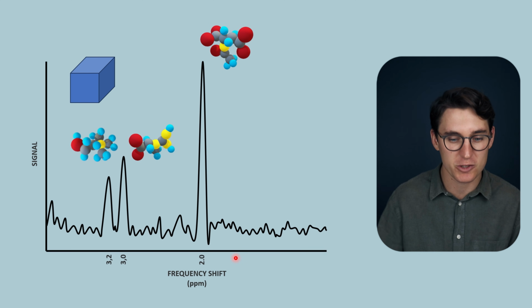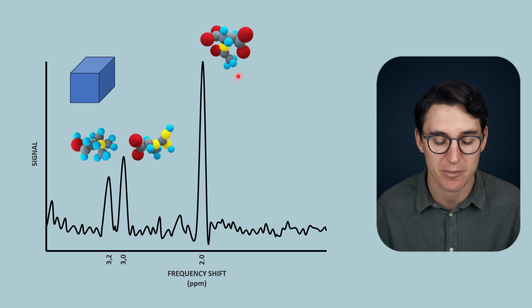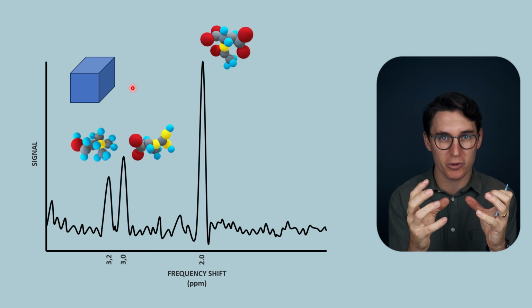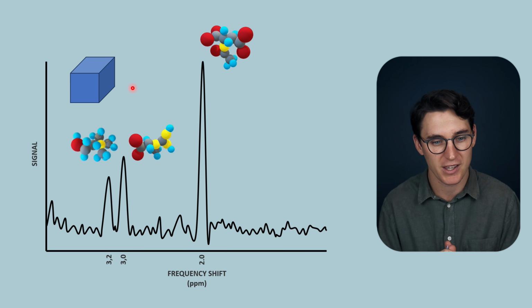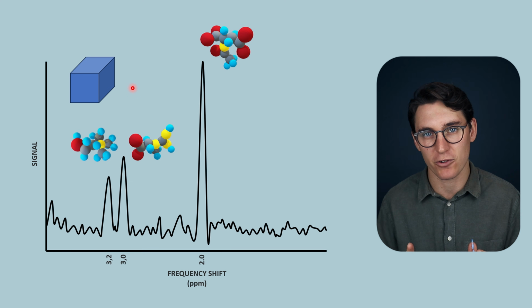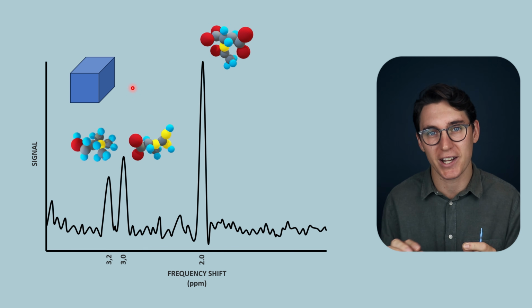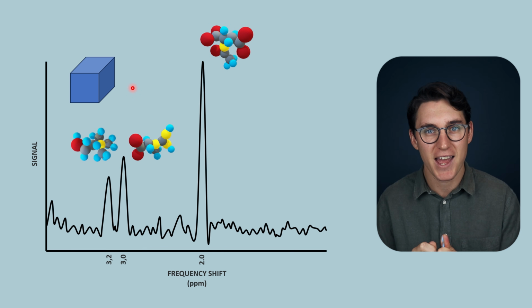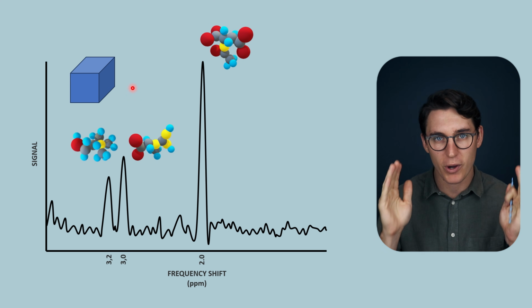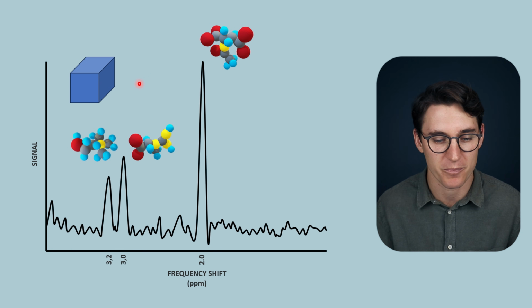And again, when we look at those metabolites, we will see there are specific signal peaks that correspond to certain metabolites. Now, we want to look at metabolites in a specific volume of tissue, or a voxel of tissue. Now, when we were looking at MRI imaging, the way we located where signal was coming from was by filling K-space, and by using a frequency encoding gradient while we were acquiring the signal, and using different phase encoding gradients every time we repeated a TR, or every time we repeated a pulse sequence. That allowed us to figure out where signal was coming from.